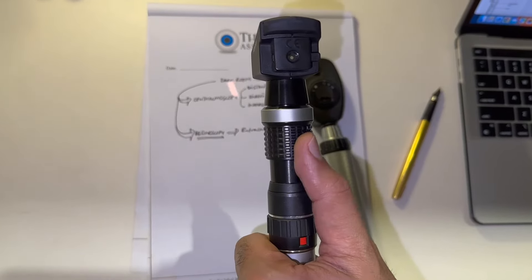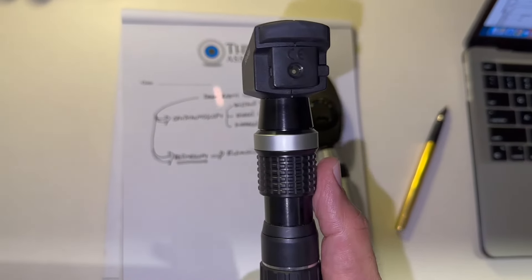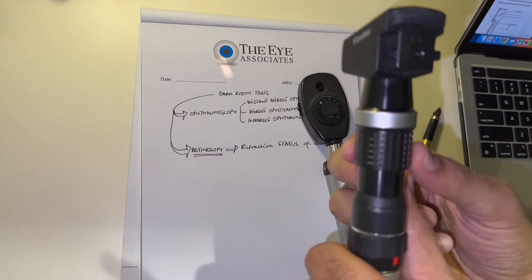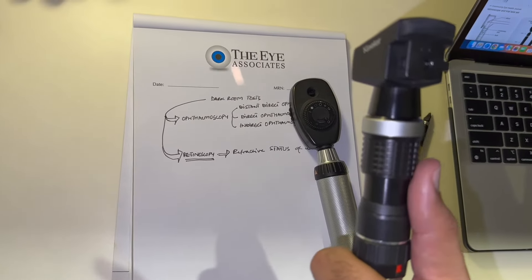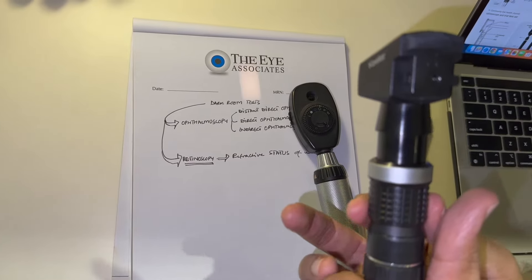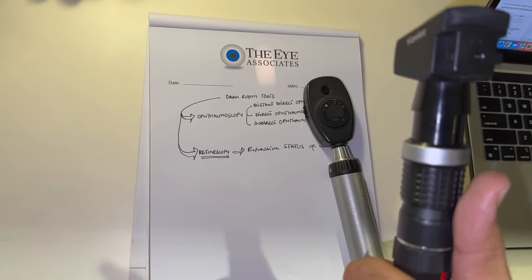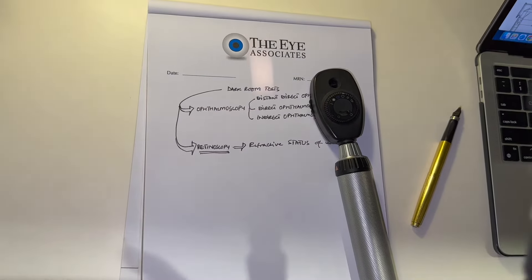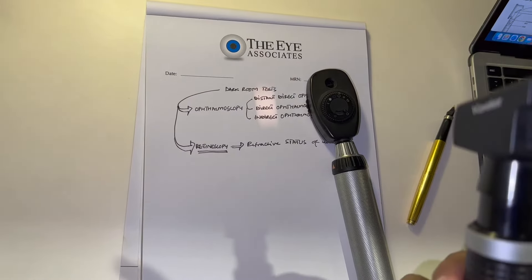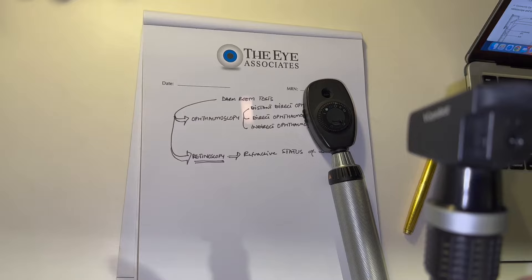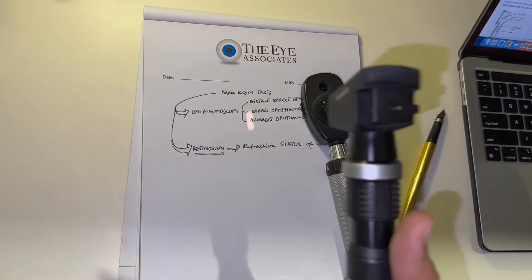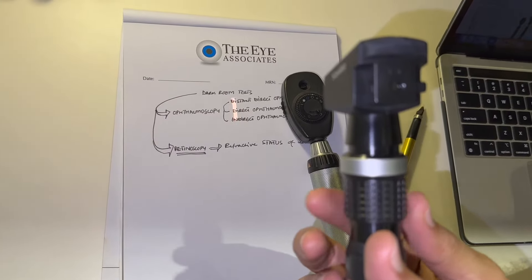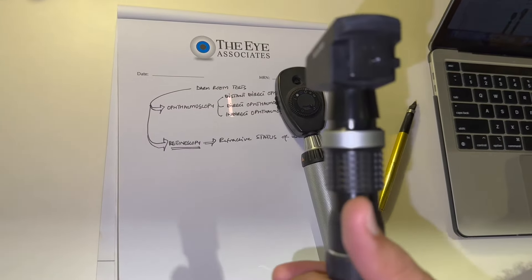By rotating the neck you can change the streak's direction from vertical to horizontal. If you move the sleeve all the way up, you will have a concave mirror; if you move it all the way down, you have a plane mirror. Moving it forward and back changes the luminance. I like to keep it right in the middle where the brightness does not change.